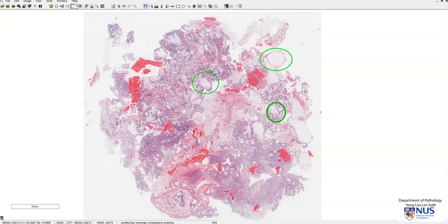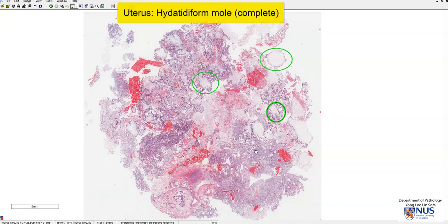This is a virtual microscopy slide of a case of complete hydatidiform mole, taken from a curettage of the uterine contents.